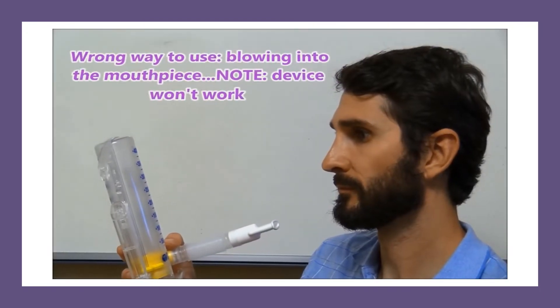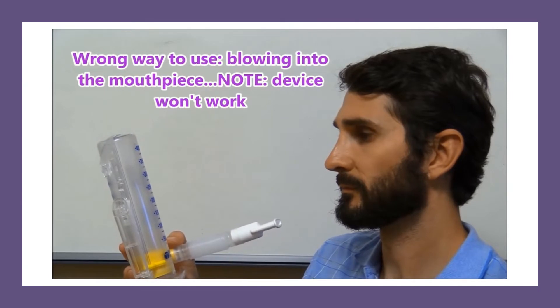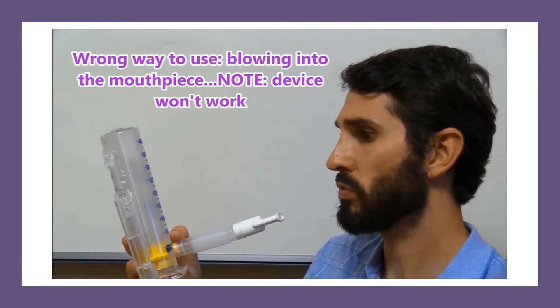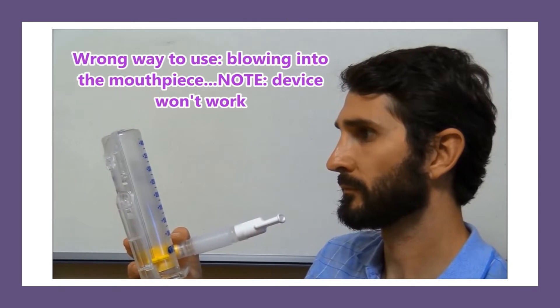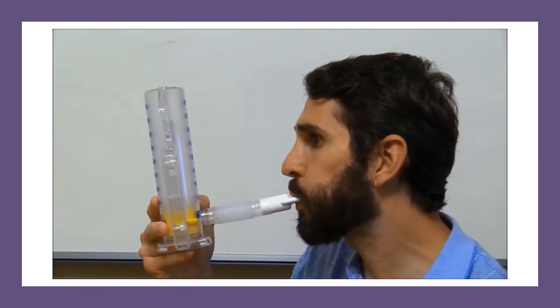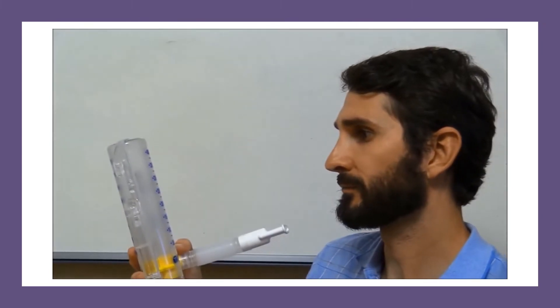First, let's go over some wrong ways to use an incentive spirometer. A lot of times, if patients haven't been educated properly, they will do what they think you're supposed to do naturally with it — by blowing into the device, rather than actually inhaling from the device.